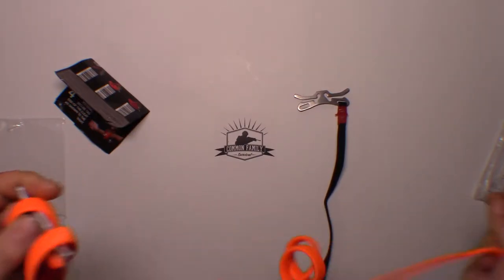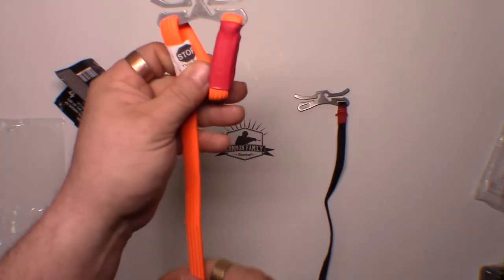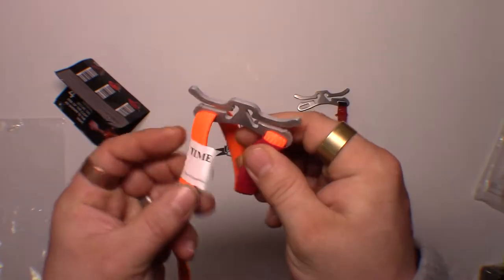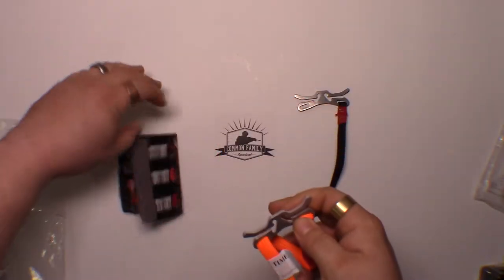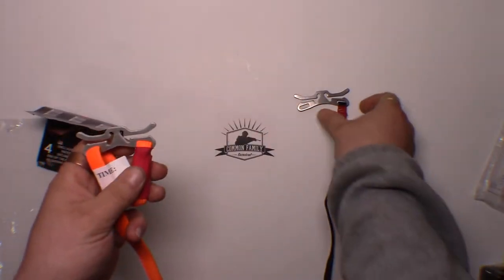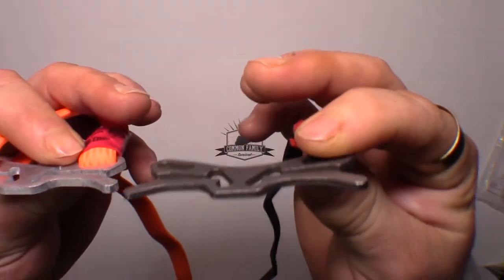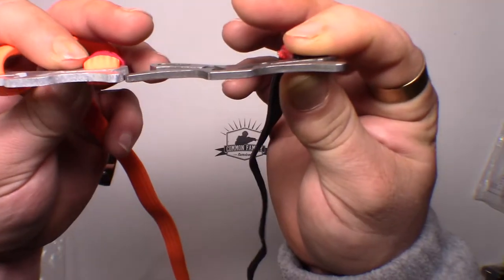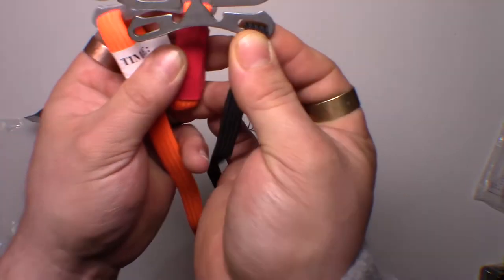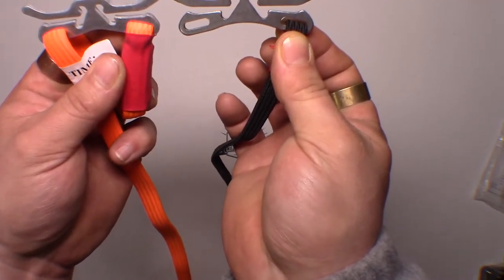Let's see what the difference is. First off, the real RATS tourniquet has a three-finger loop stop - there are directions on how to apply it, showing you how to do it. As far as the metal clasp goes, they're pretty much identical. The real is a little bit thicker versus the Chinese repro which is a little thinner, but design-wise they're pretty much exactly the same - I don't see any difference whatsoever.